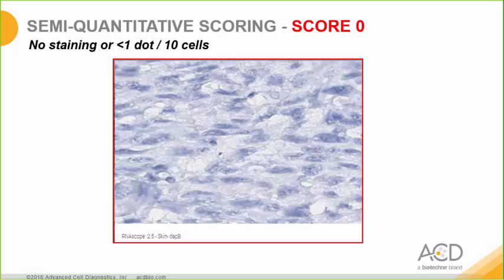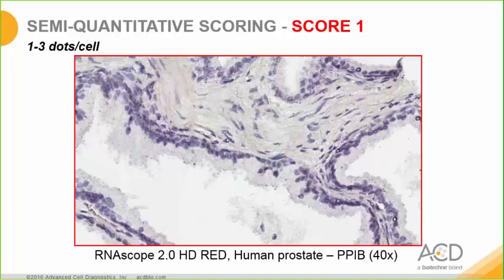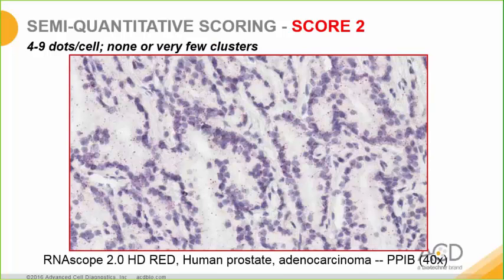Here's a sample stained with the DAP-B negative control marker having no dots, thus with a score of 0. In this sample, most of the cells contain from 1 to 3 dots, thus getting a score of 1. In this sample, most of the cells contain from 4 to 9 dots, with no or few clusters, thus getting a score of 2.